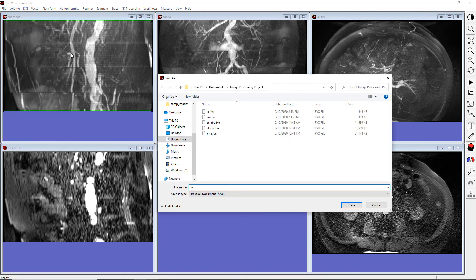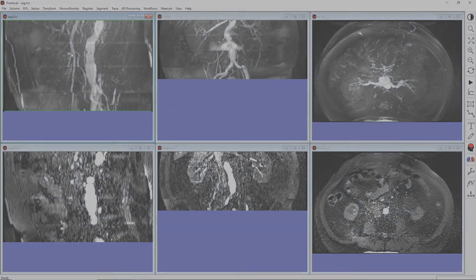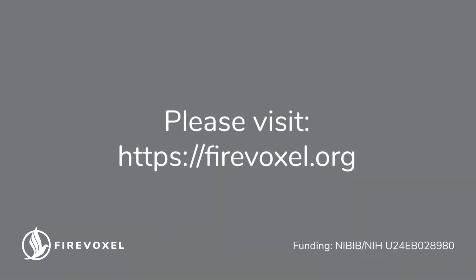And now we have all three maximum intensity projections for this image set. This concludes this tutorial on FireVoxel viewing options. For more information, please visit our website. Thank you.